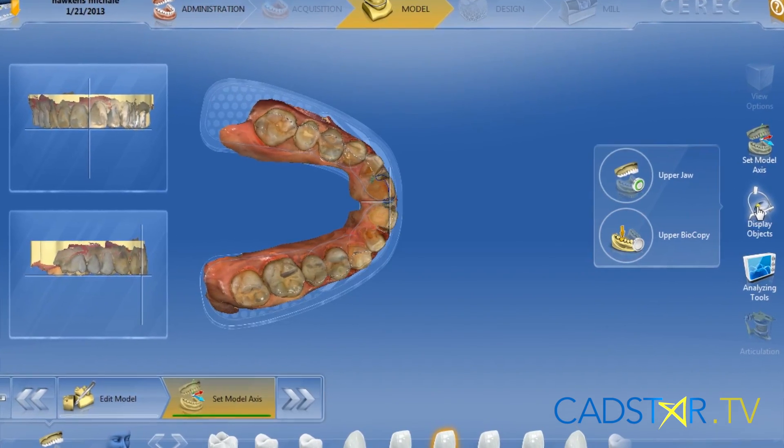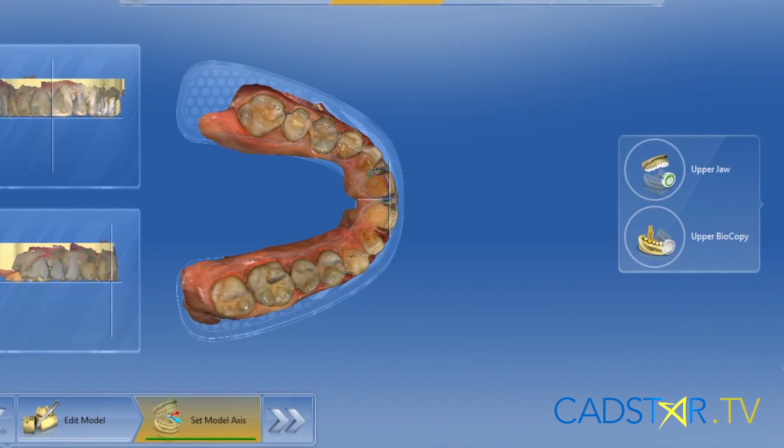The articulator will also recognize anterior guidance. Whatever we scan in — I'm scanning to the contralateral canine of the quad I'm working on — it will all be there, and I have found it to be very, very accurate.